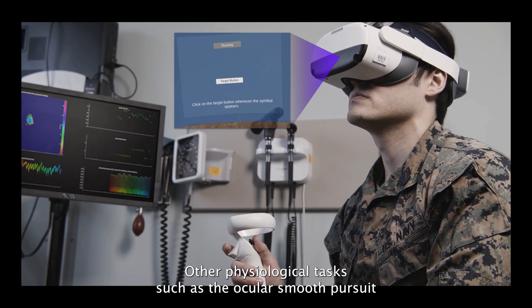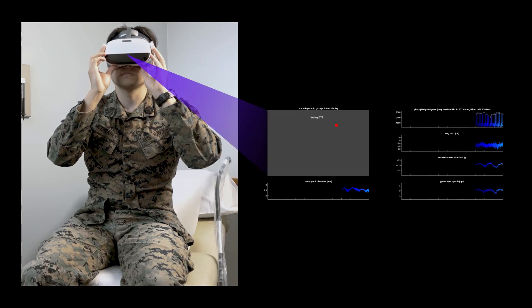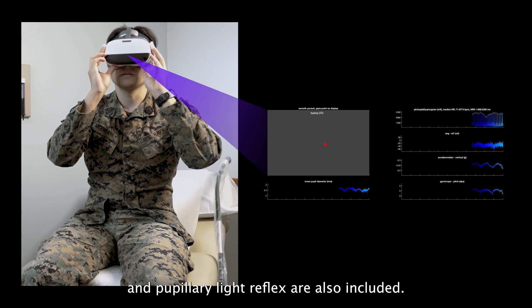Other physiological tasks, such as the ocular smooth pursuit and pupillary light reflex, are also included.